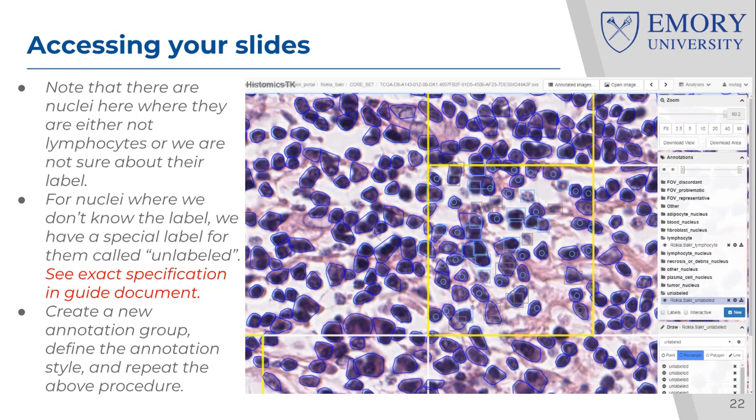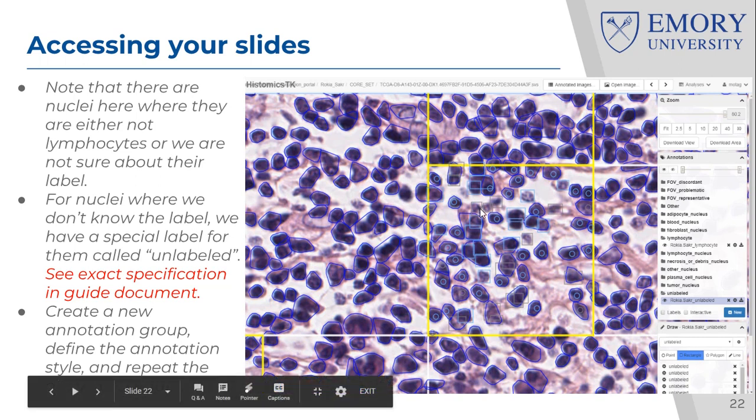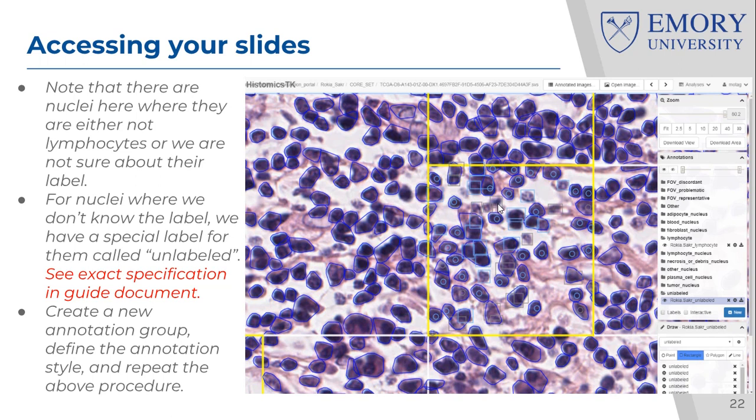Even by an experienced pathologist, we cannot tell for sure, right? But if you're a non-pathologist and you haven't done many fields of view so far, you're not really confident. For example, you're not sure, is this a fibroblast or is this a lymphocyte? If you're not sure and you're not experienced, don't just label it as unlabeled. No. Go to the group and ask.